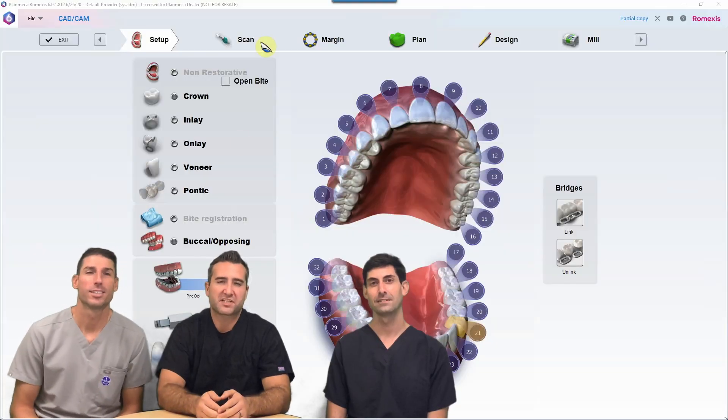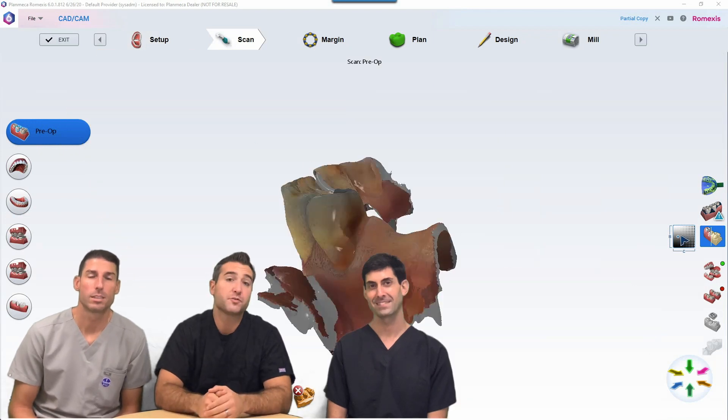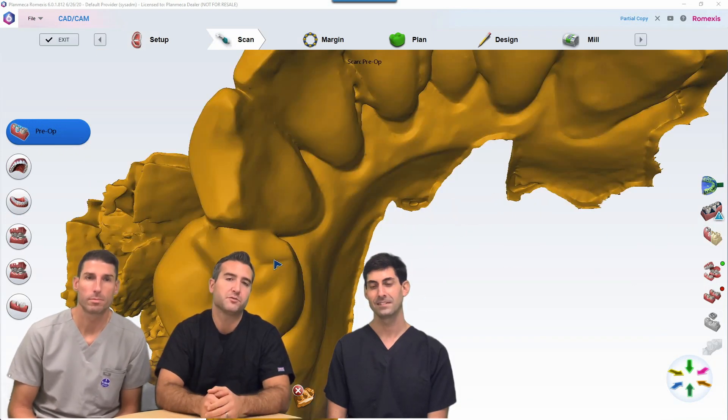Hey everybody, welcome back to 60 Seconds with Remexis 6. We have Tony and Zach, and today we have a question from one of our users about how to copy a tooth that an RPD fits on when you do a new crown.